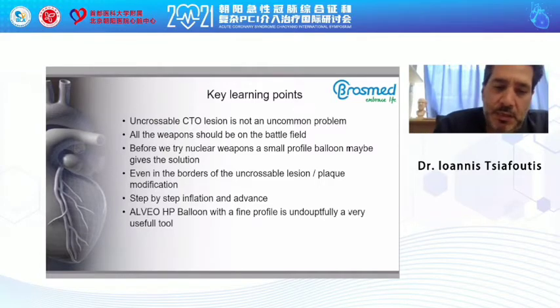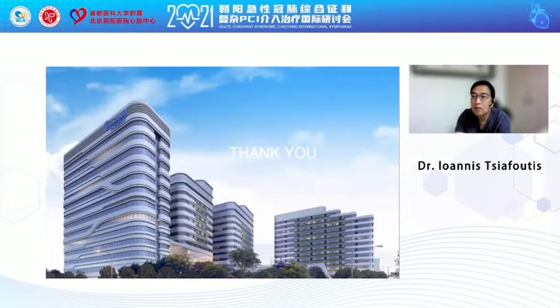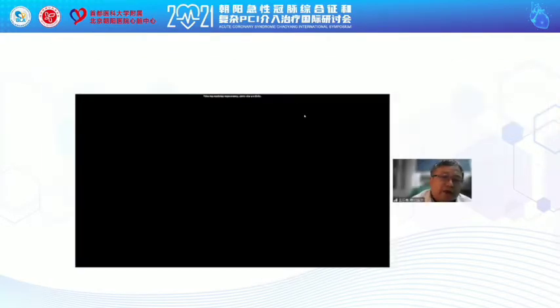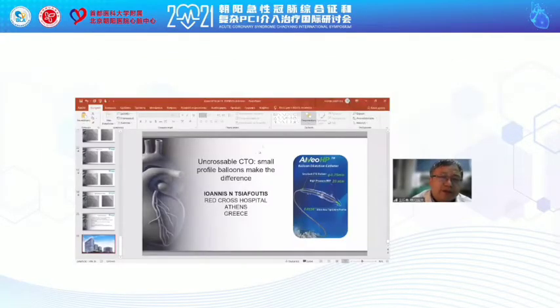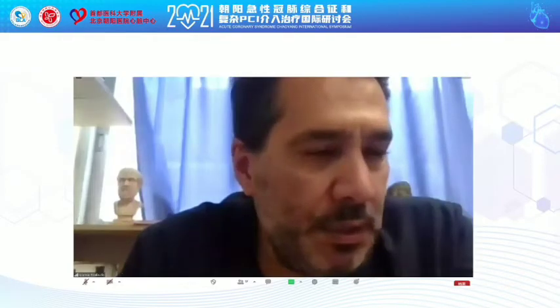Thank you, Dr. Cianfotti. What's your usual dilating pressure in this profile balloon? Yeah, it's ideal for going up to 20 atmospheres. You can go up to 20, and I use it this high.